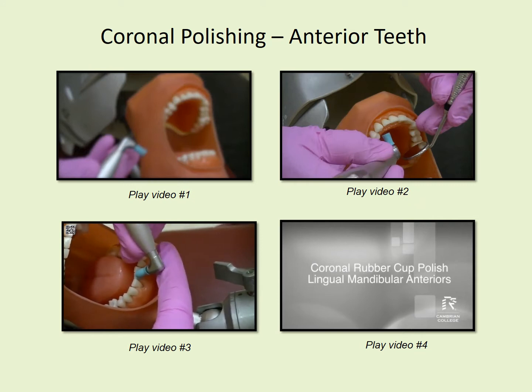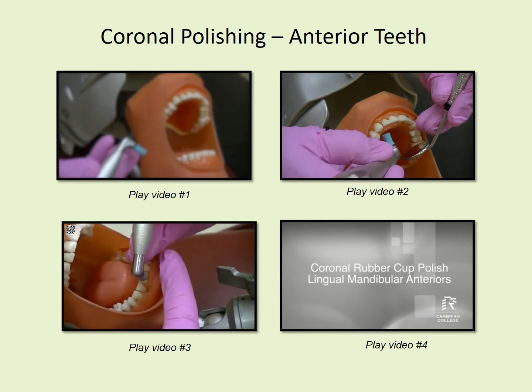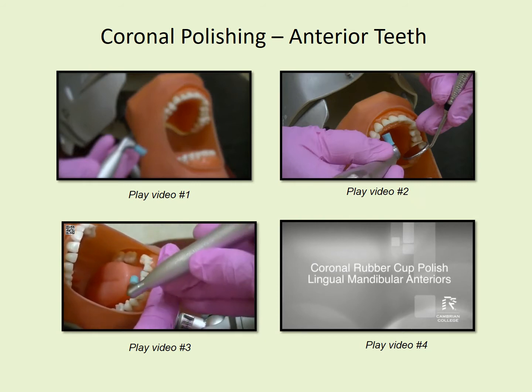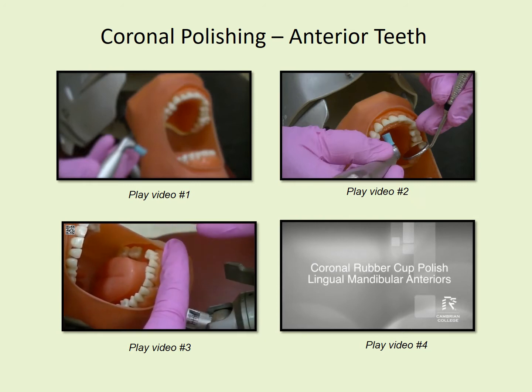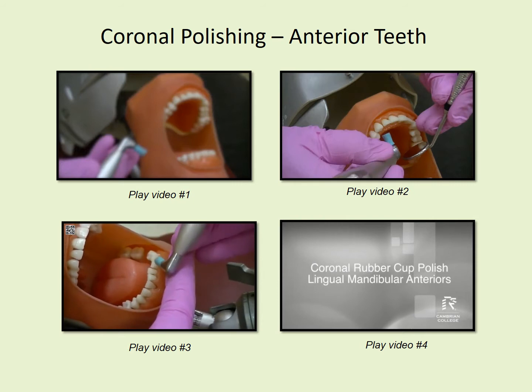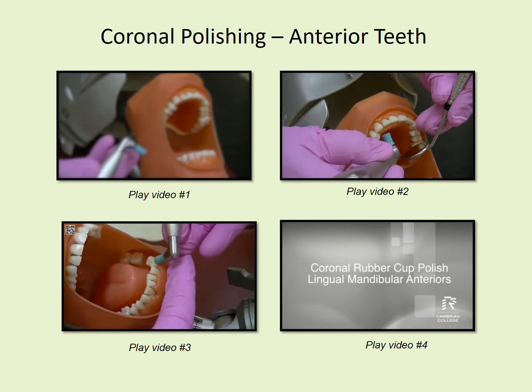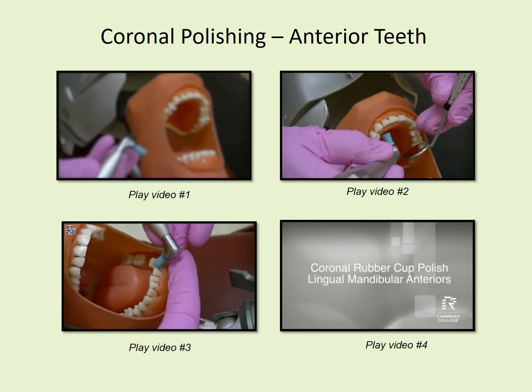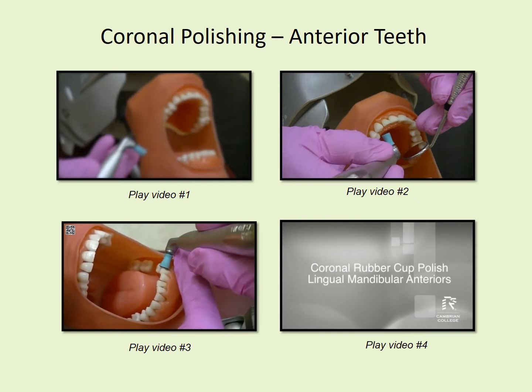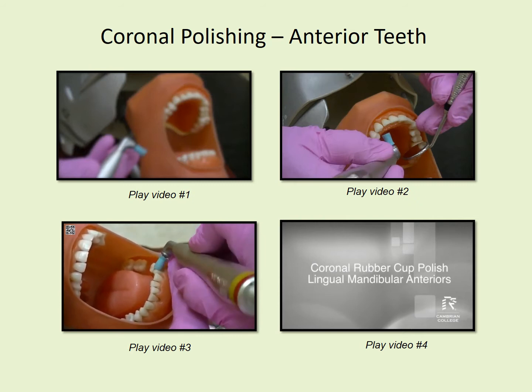wherever you're able to, and then when you're not able to do it comfortably anymore, you would put your hand on top of your index finger of your left and just use a built-up fulcrum for the remainder of those mand anteriors, and finish off on the canine from this position. Oops, well, you can even do the distal as you swiveled it and going this way actually.